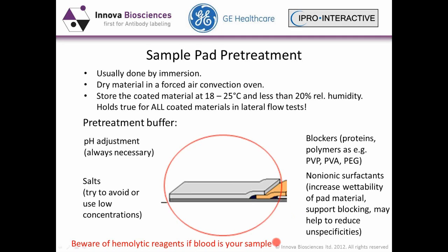If you plan to develop a serum-based lateral flow test, keep in mind that sooner or later somebody may ask you to run the same test with whole blood as a sample. In that case, it's a very wise decision to develop the serum-based test with reagents that are not hemolytic. That means that they do not lyse red blood cells.